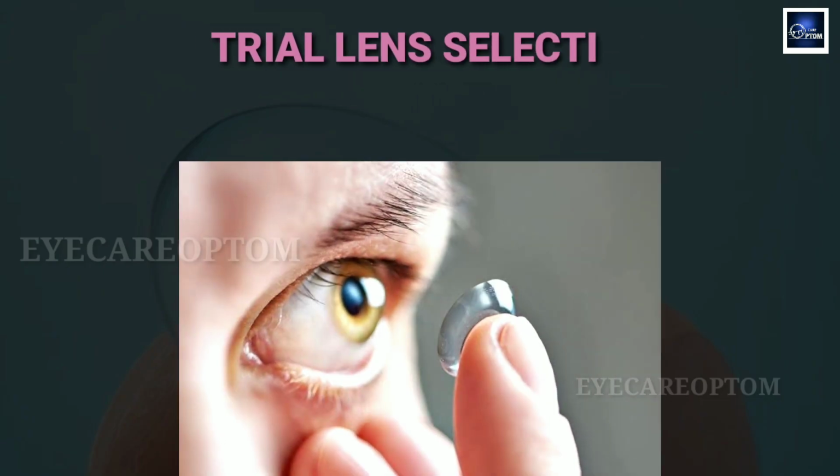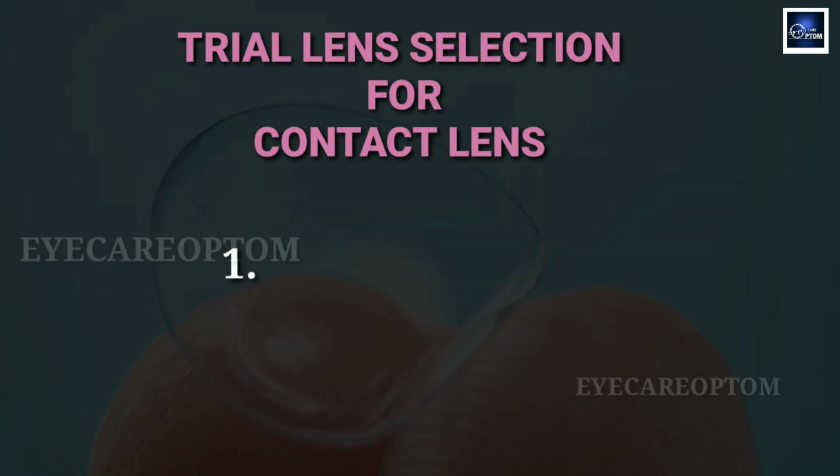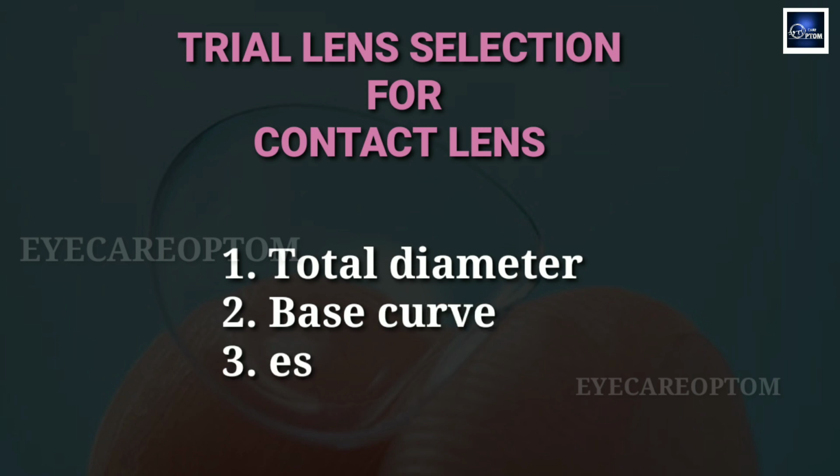So today I'm going to discuss trial lens selection for contact lenses. When it comes to trial lens selection, we should look for three main factors. First one is total diameter for the contact lens. Second one is base curve for the trial lens. And third one is estimated power for the trial lens.